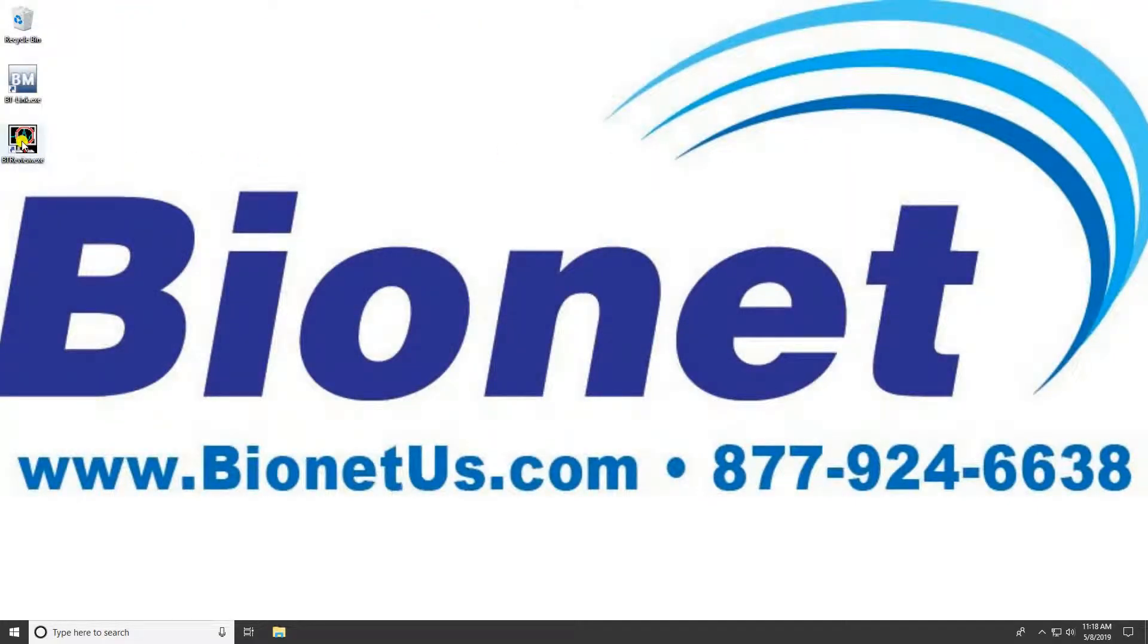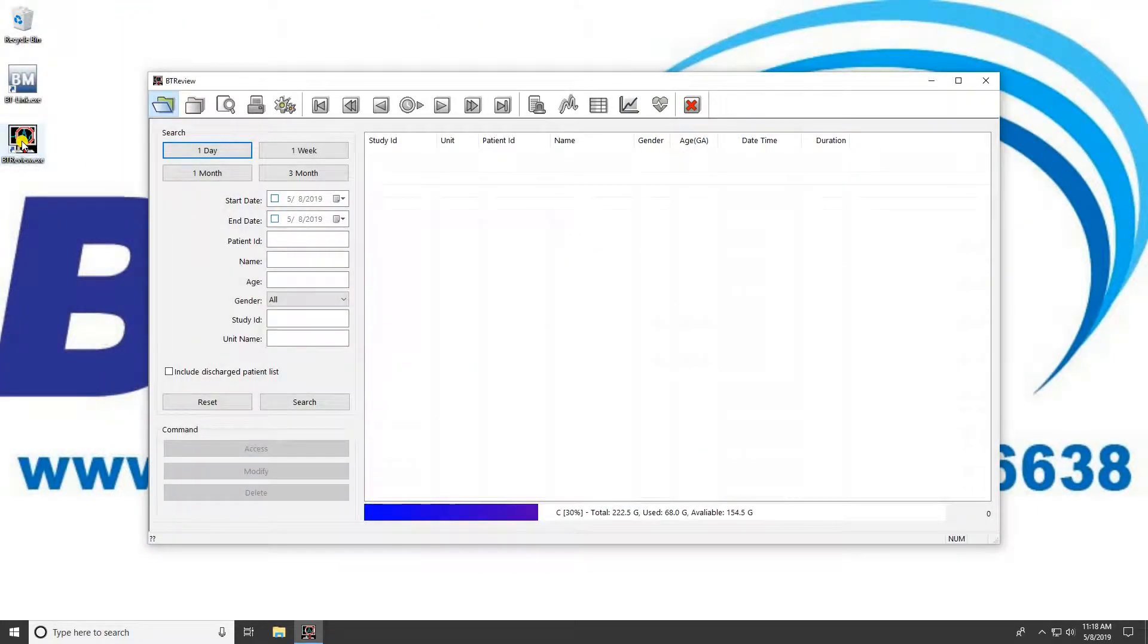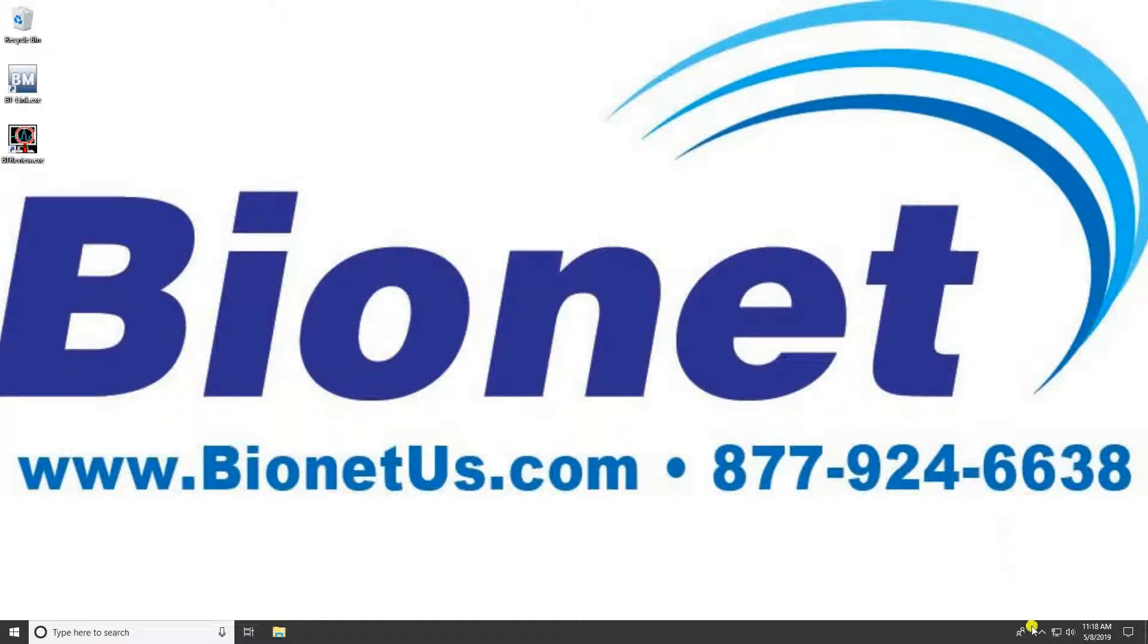The first is to click on the desktop shortcut that was created when the program was installed. This allows your practitioners to use the program separately from BT-Link.